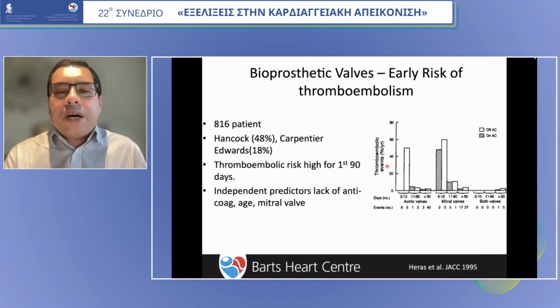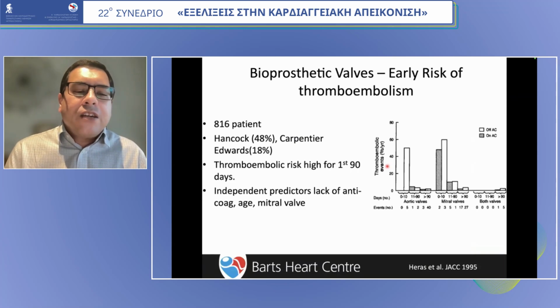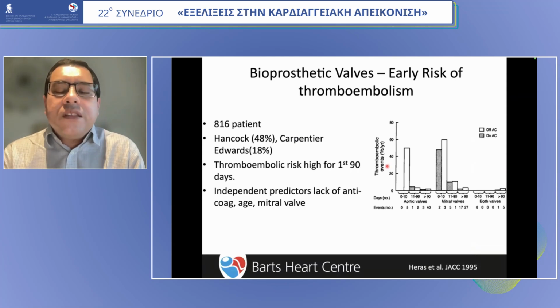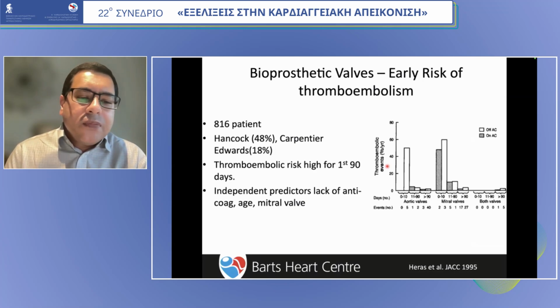But let's talk about bioprosthetic valves, because traditionally we've thought about thrombosis on mechanical valves. So early after your bioprosthetic valve, there is a risk of thrombosis.